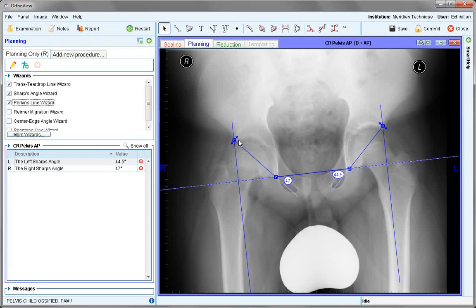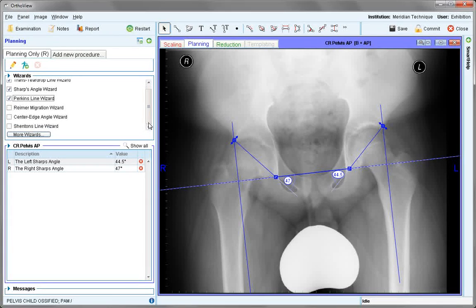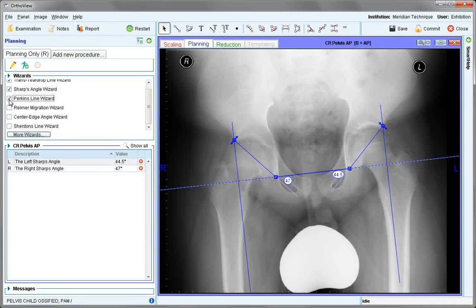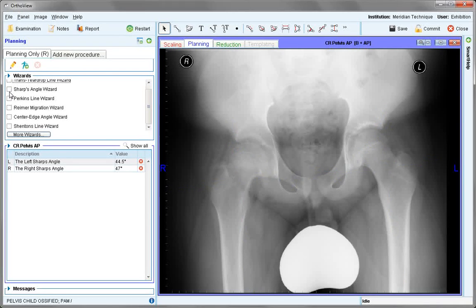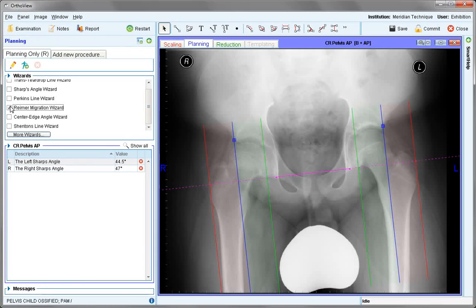The additional wizards will now be used to assess femoral head position. Reimer migration index is the first of these, and it's best seen if the other wizards are turned off. These will be turned off now by just deselecting each of them, although their information is still retained. It will use common reference points if they've already been identified.